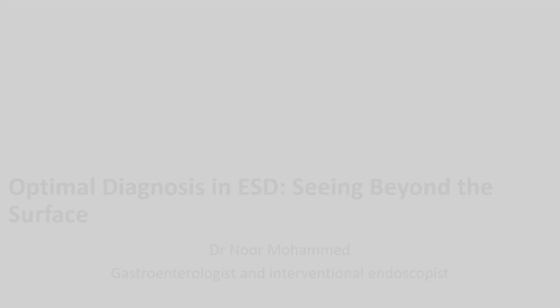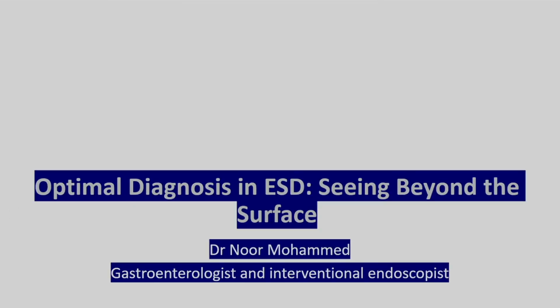So as endoscopists, what do we do? We throw some light on. So contrast enhancement does give you better understanding, better outlining of the lesions. So I'm glad people noted that it wasn't the right slide. It was because of the intention.